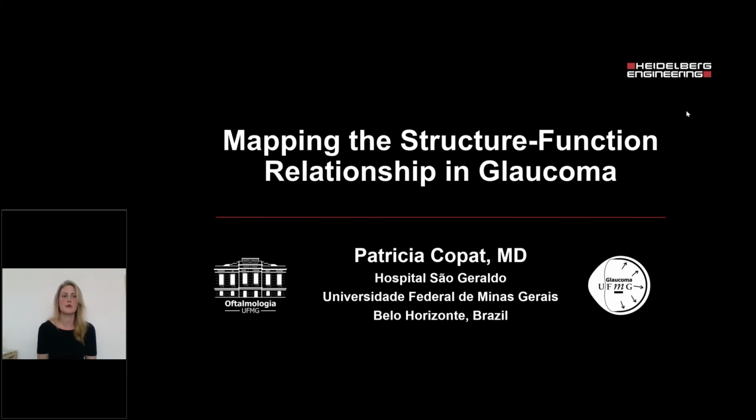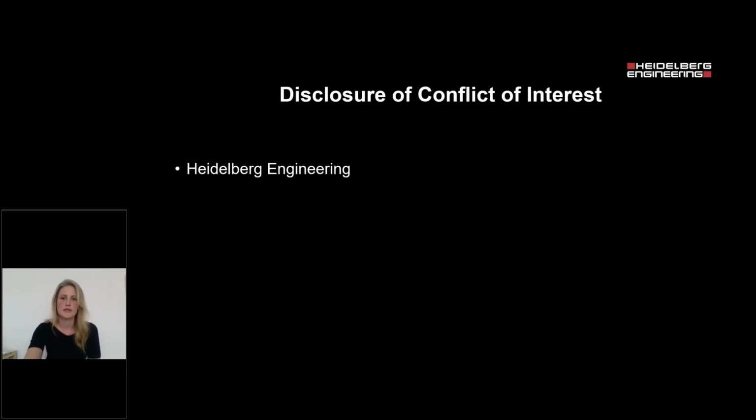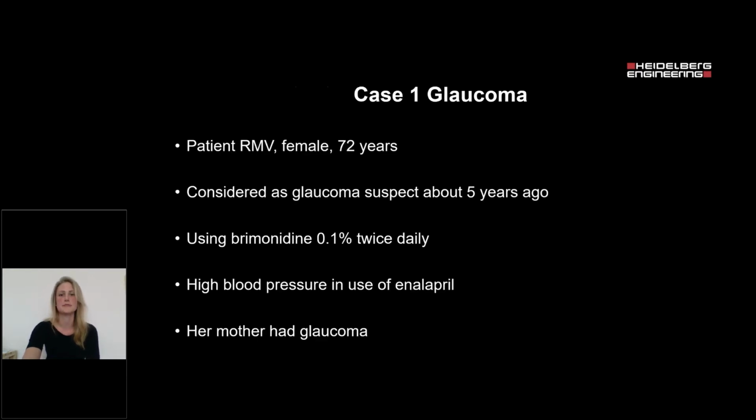And today I will present a case related to the topic mapping the structure-function relationship in glaucoma. I have this disclosure of interest, Heidelberg Engineering.